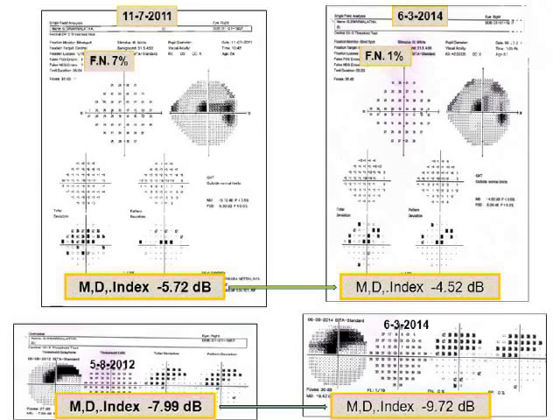See, in this case the glaucomatous process is actually starting in the central area, 10-2, in the macular-papillary bundle area. So the most important thing, even for the progression analysis, is that you have to concentrate on where the point patterns are, and select and do them.